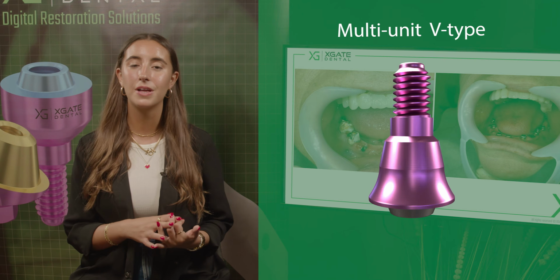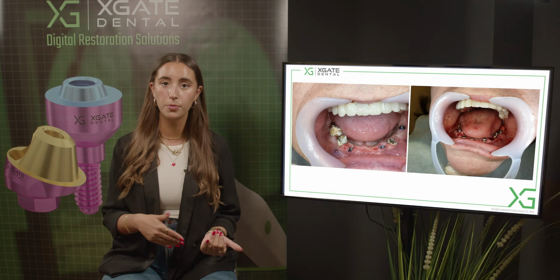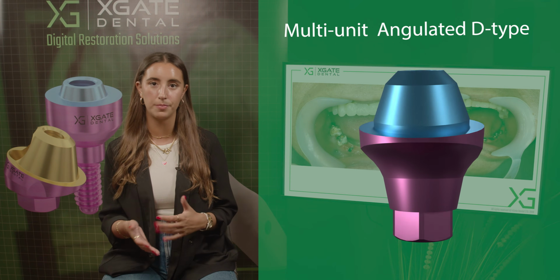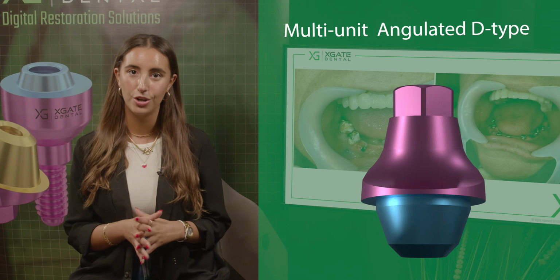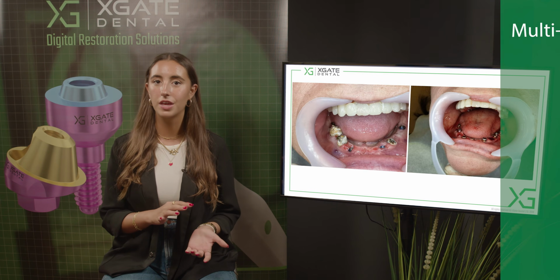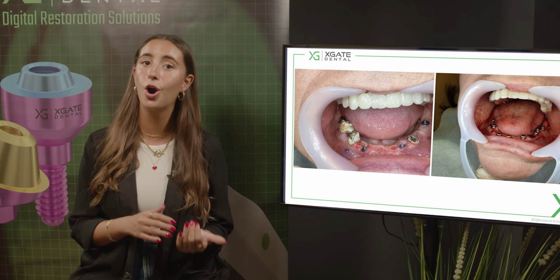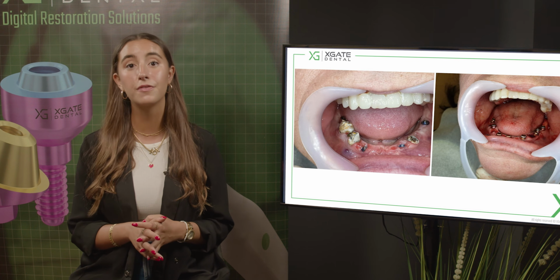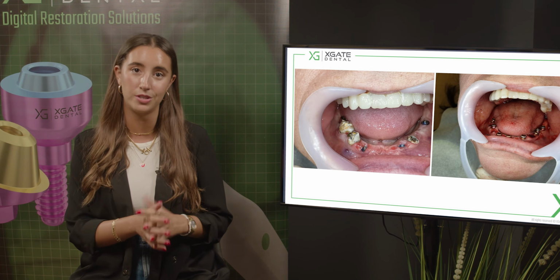Now we place the implants on the lower mandible in 2 steps. The first step, we took off the bridge and we placed about 4 to 5 implants. And you can see that we have an implant around the second molar. We can have an implant around both canines and around the second premolar and second molar also, and we returned the PFM bridge that she had before, and we gave those implants some time to osseointegrate.